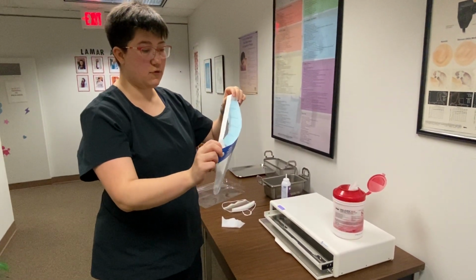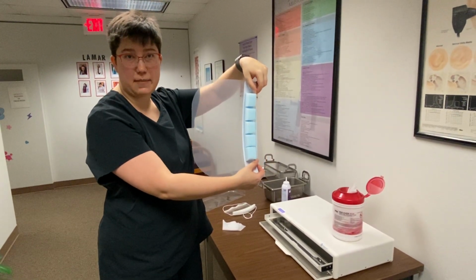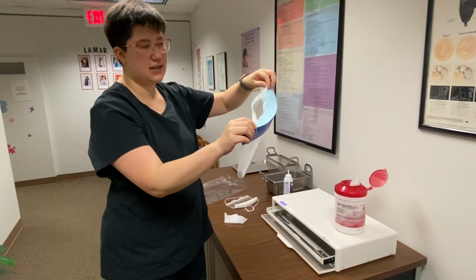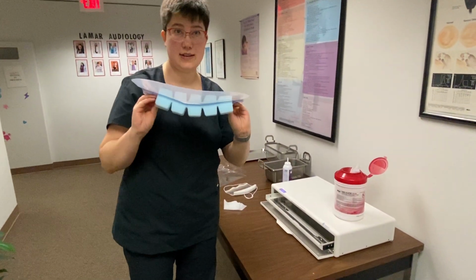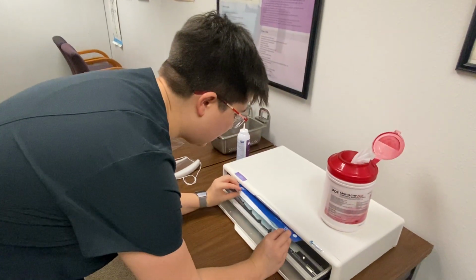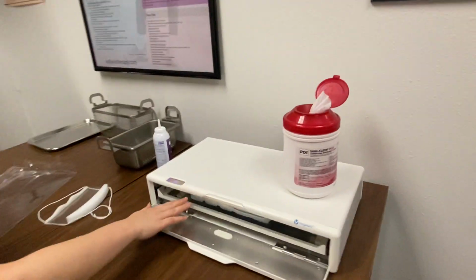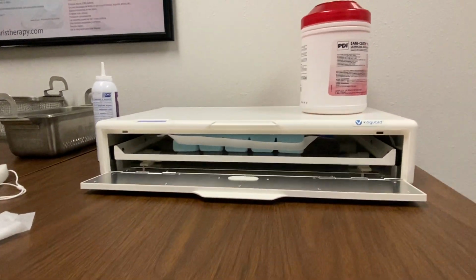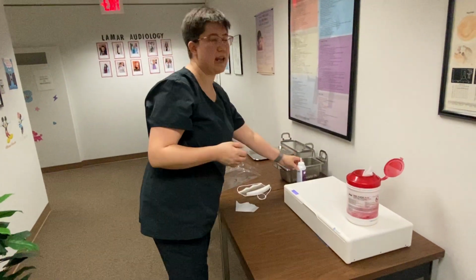The only thing that's kind of weird about this is, because the part we can't sanitize with chemicals is the foam, right? So you need to pull the elastic up like this when you're putting it in. To get it in here, you're going to slide the open bottom in first, and then slide that like this. And then you push, and see, it comes in here. It kind of straightens it out, and it leaves the elastic out so that the light can get to it. And then you shut the door, and it's going to run the same cleaning cycle.